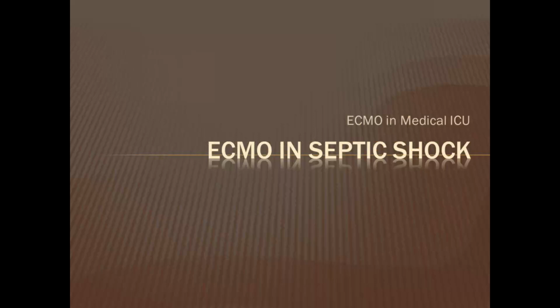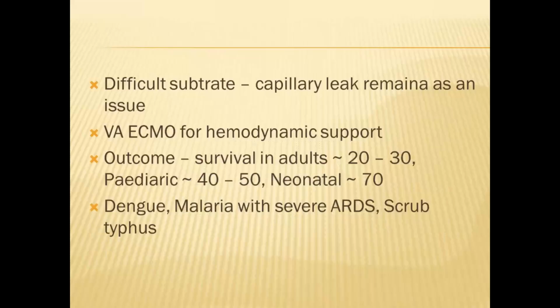So ECMO in the medical ICU can be used in septic shock, in poisoning, and in hypothermic coagulopathy. ECMO in septic shock is a difficult substrate to start with. There will be a lot of capillary leak, and it's going to be difficult to balance the fluids because of that. You will end up having a lot of fluids. So initially, I would not advocate that people think of ECMO in sepsis to start with.